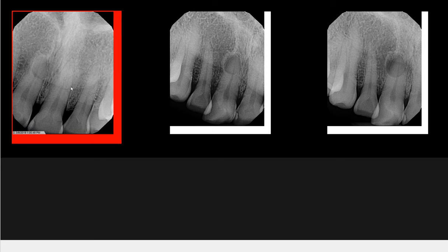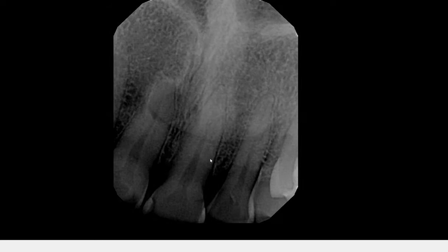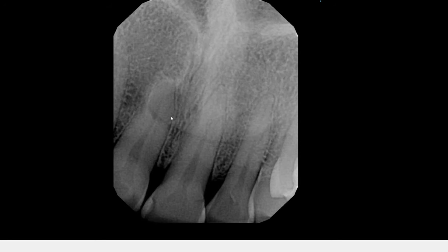Look over here. We're seeing a periapical radiograph of the maxillary central incisors. You can see the intermaxillary suture and the outline of the nose. Additionally, there is a partly well-defined radiolucency that is superimposed over the apical third of the root.